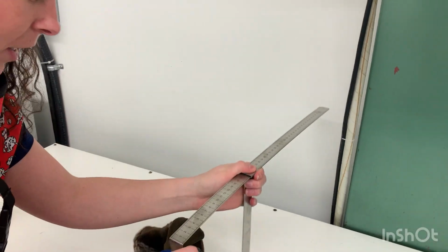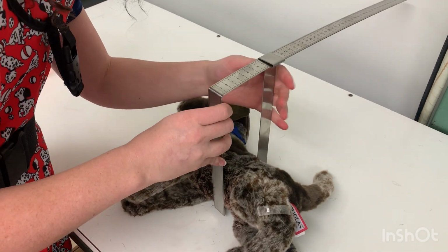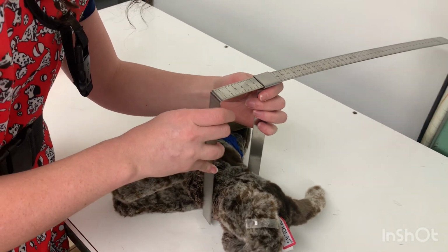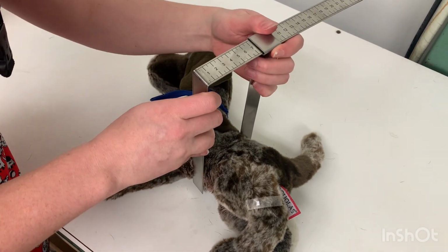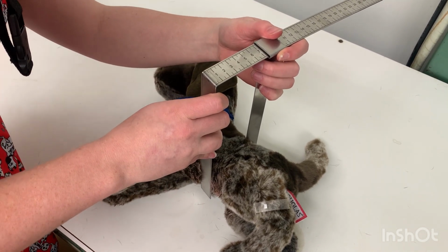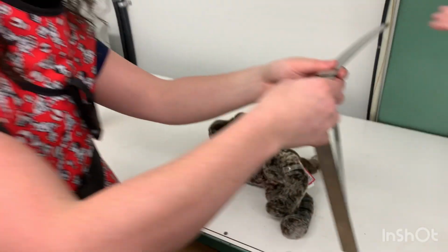The collimator is up here, looking at where it's hanging. So, just taking a measurement of the widest aspect of our abdomen, you're going to see here, it's going to be just over about 7.5. So I'll hand this back to you.